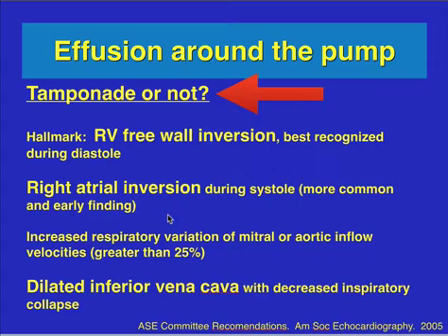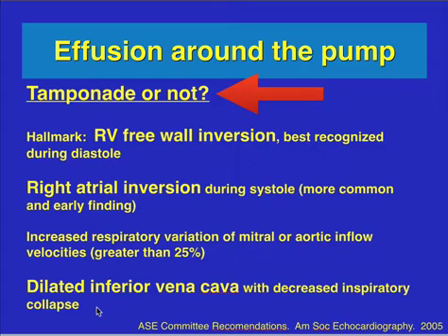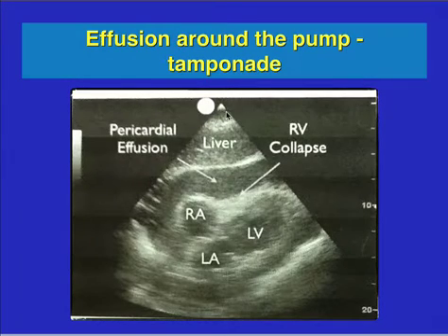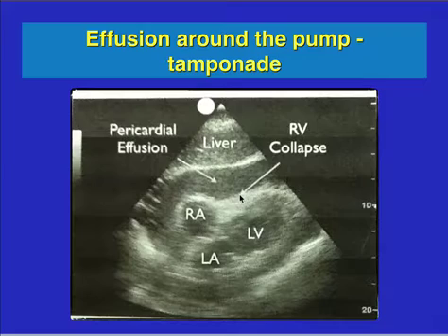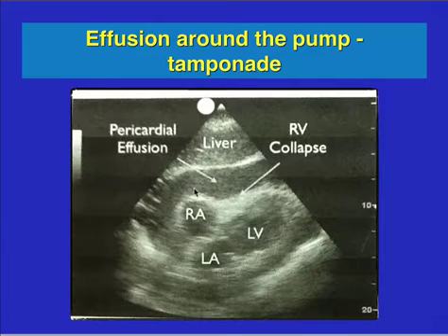Now, what's important to us is whether there is tamponade. The hallmarks of tamponade are: right ventricular free wall inversion, best recognized during diastole; right atrial inversion during systole, which is a more common and early finding; increased respiratory variation of the mitral or aortic inflow velocities, though in the ICU we don't usually calculate those; and a dilated inferior vena cava with decreased inspiratory collapse, though that's not always found. Here in a subcostal view, you can see the pericardial effusion — and even though the right atrium is still open, the right ventricle is collapsed, indicating a high-pressure effusion or one that has accumulated more recently.